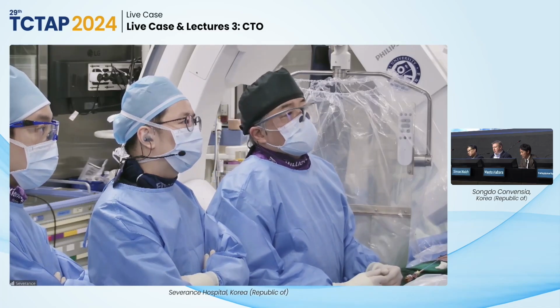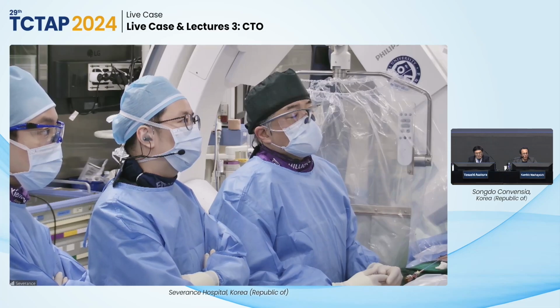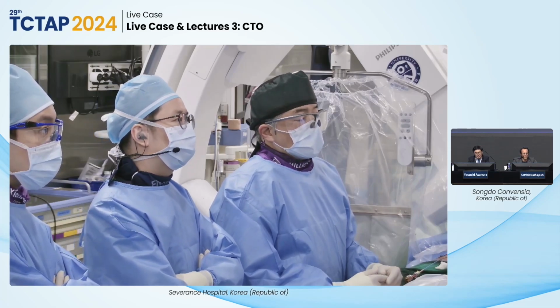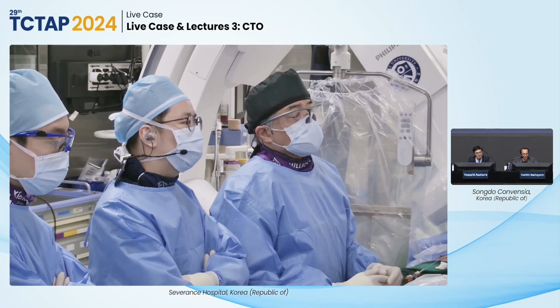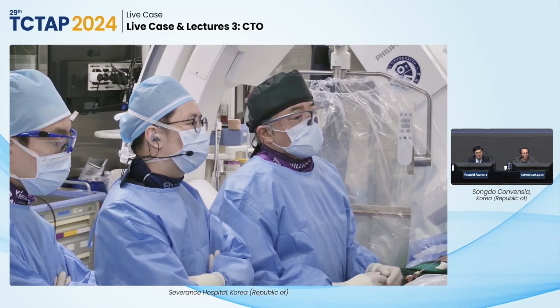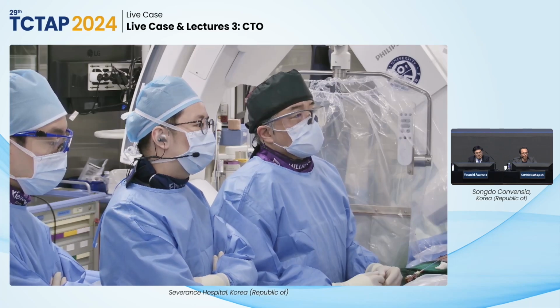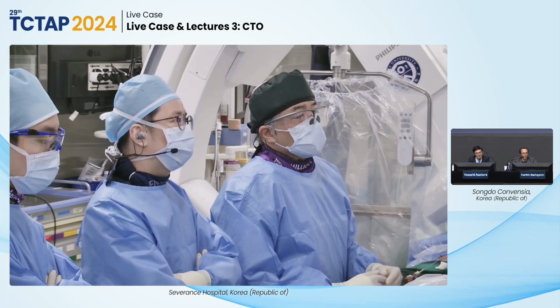Well, first of all, thanks for the great case introduction. I think this patient clearly benefits from revascularization. This is the most important thing here in three vessel disease. And as well, the RCA is quite a large RCA. So I think you have very good options, antegrade as well, retrograde for sure. I think the most important thing will be, as always, the antegrade cap to solve that issue, and then we'll see how the wire is going. So did you already puncture the antegrade cap?